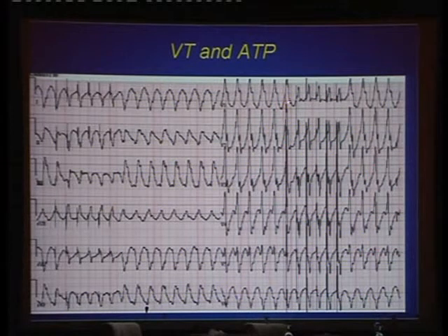So in fact, this paced beat, not only its wavefront captured the local right ventricle and intervening left ventricle, but actually got into the circuit because all the subsequent beats are equally fused. So it meant that we've entrained it with the very first beat, but we're unable to terminate it. Who cares? Well, it's cool. That's who cares.